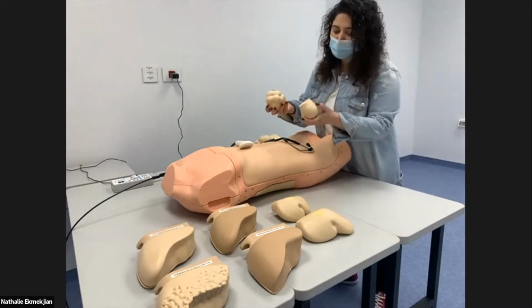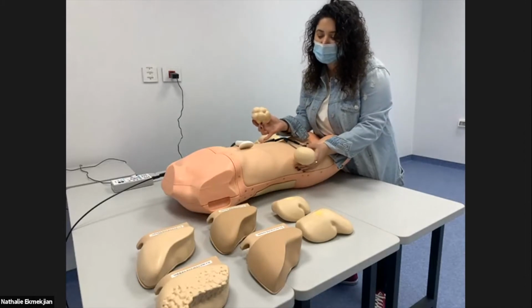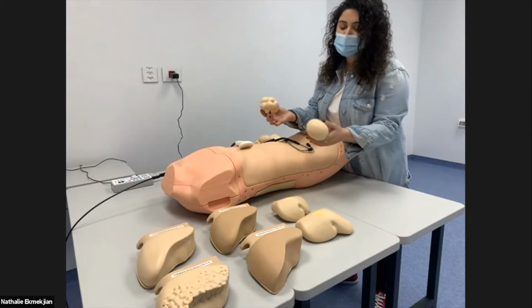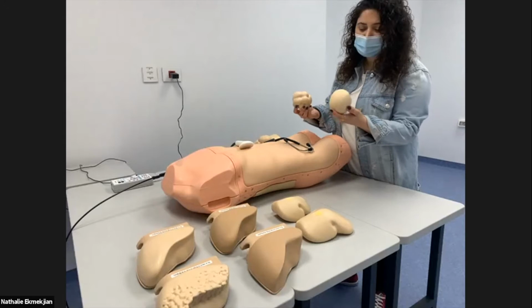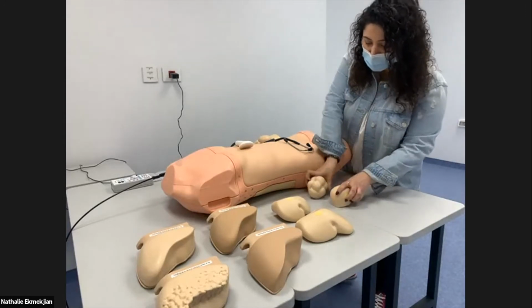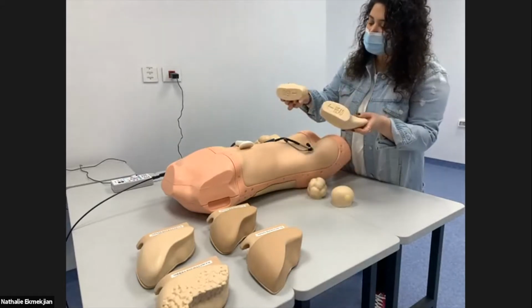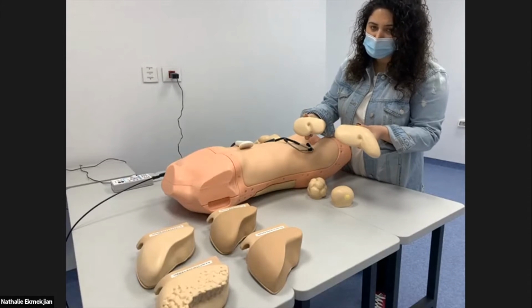So we have the kidney, and when we don't put any organ, it represents normal kidney. And when we put one of them, this one represents a hydronephrosis and this one cyst. Those are the spleen, slightly enlarged and enlarged.